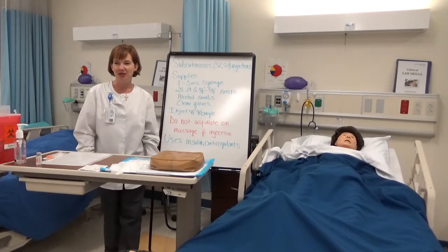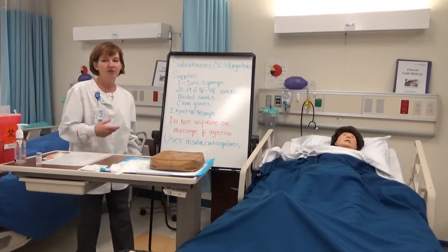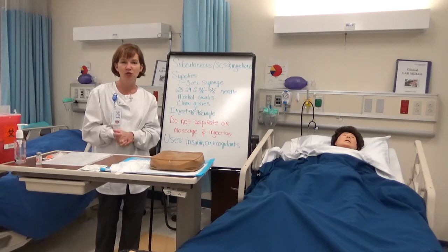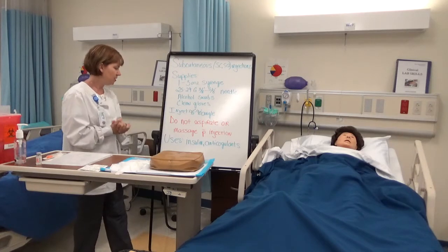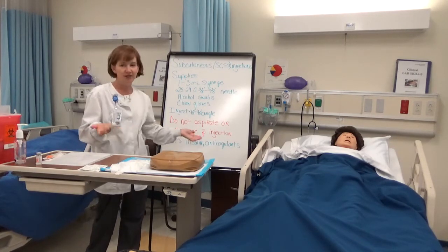I'm going to demonstrate to you how to draw up a sub-Q injection. For today's demonstration, we're going to use insulin. There are other reasons, though, you might need to use a sub-Q injection, and that would be for anticoagulants.